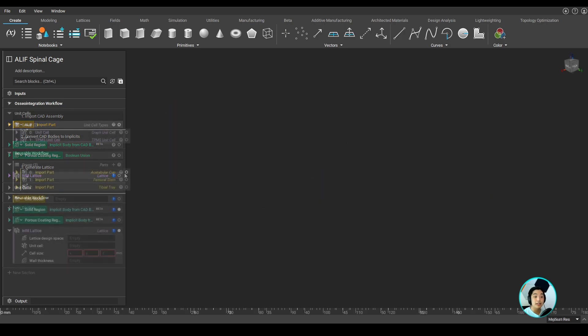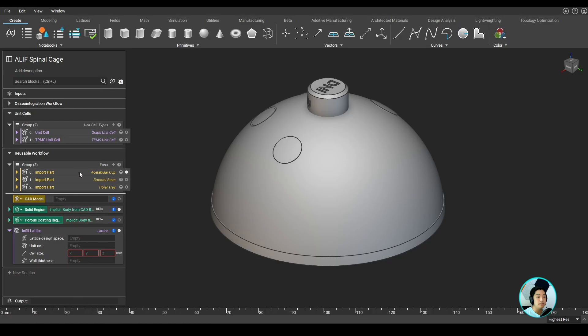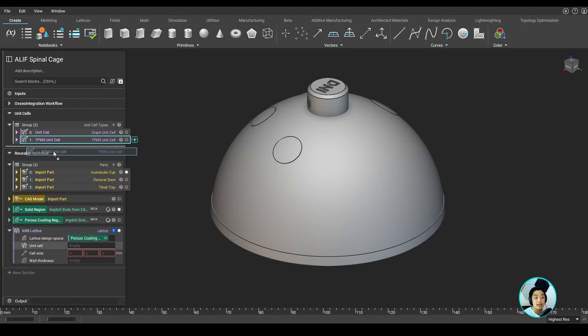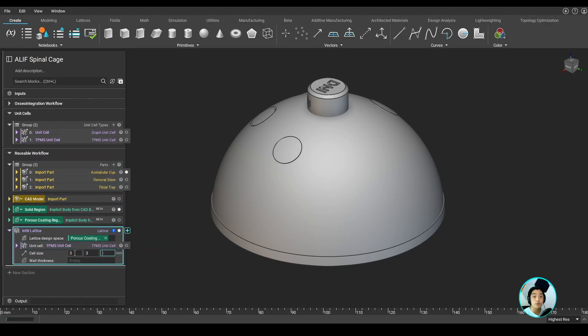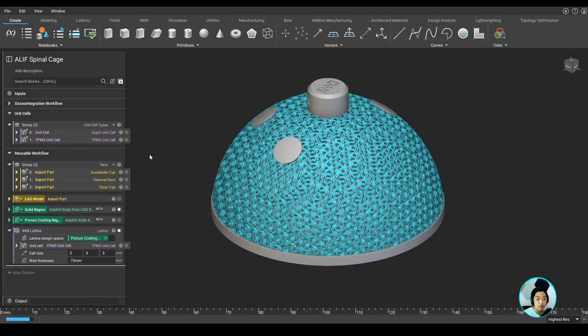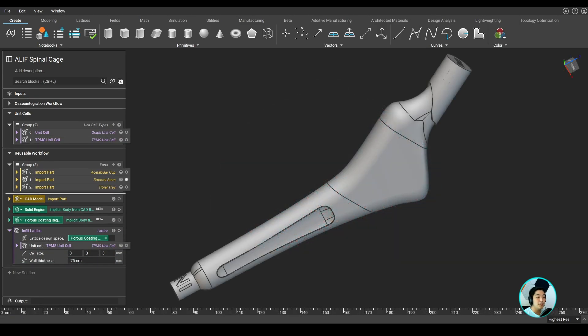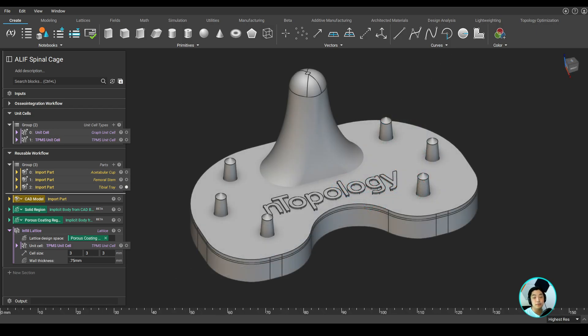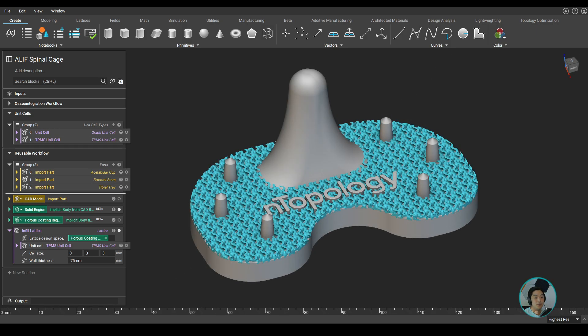For example, I can fill in the same lattice parameters as above and drag in this acetabular cup, and we can see that workflow regenerate the same exact lattice, but on a fundamentally different part. If we wanted to apply this to a femoral stem, we can do that as well. And the same applies to a tibial tray.